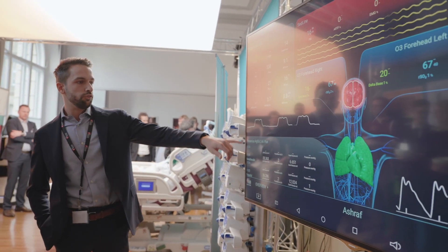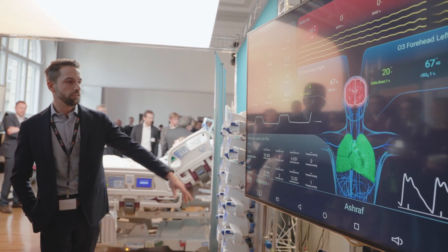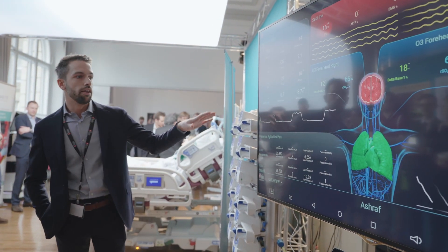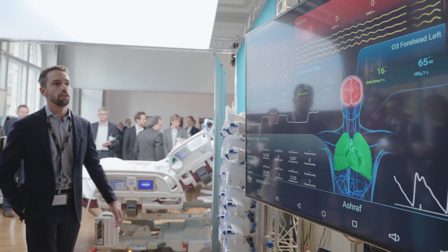You can see here the infusion pumps — all the different Fresenius pumps with the different flow rates and everything that is being infused to the patient.